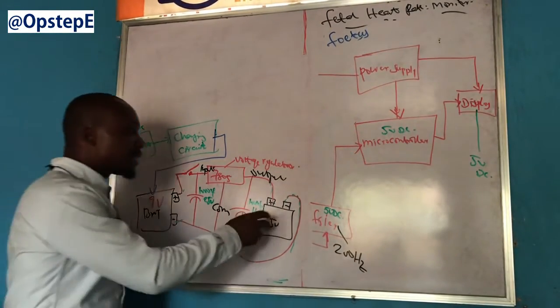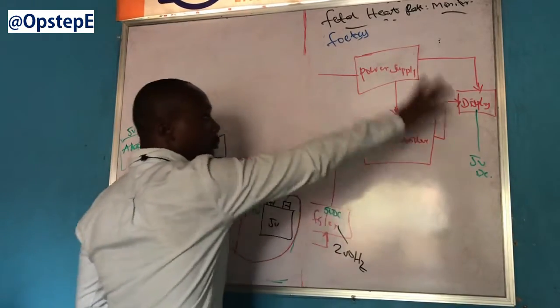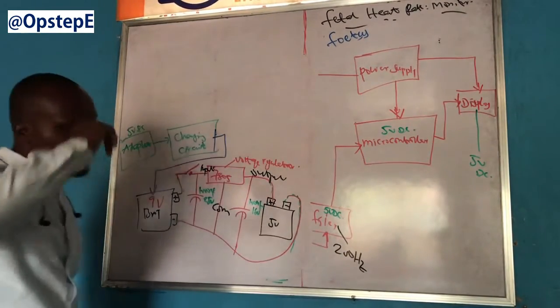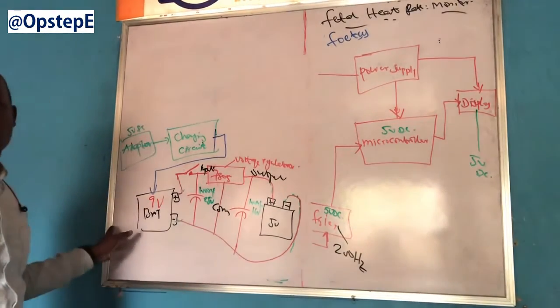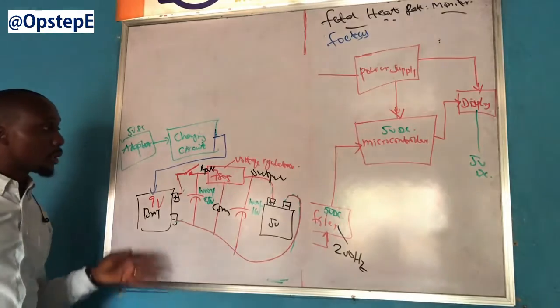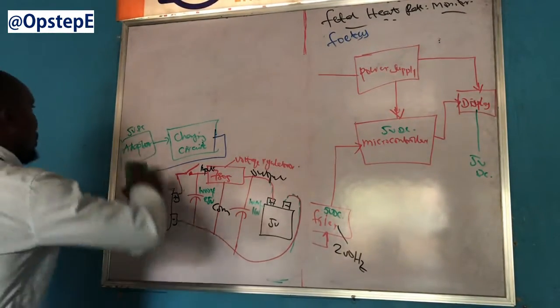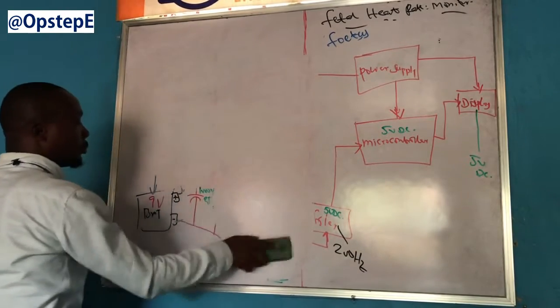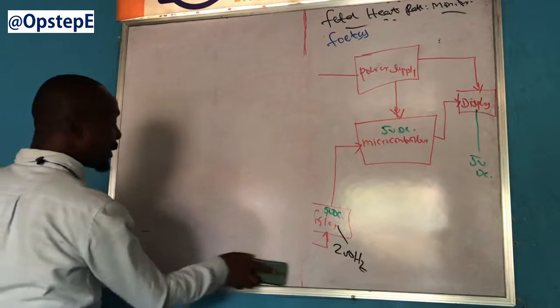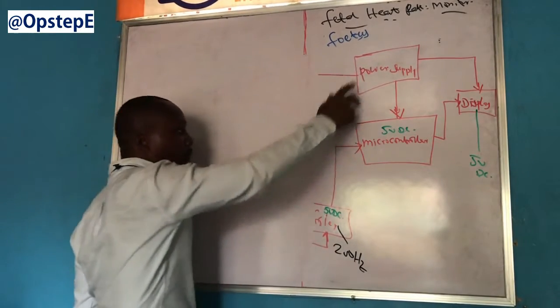Now, this 5 volt system that I drew here will be your what? The system. Because don't forget, every aspect of the system requires what? 5 volts. So this clear? You understand this? Can I clear? So that is in explaining the power supply.